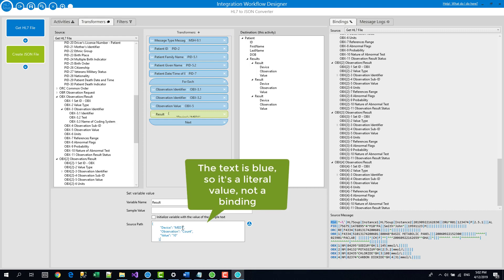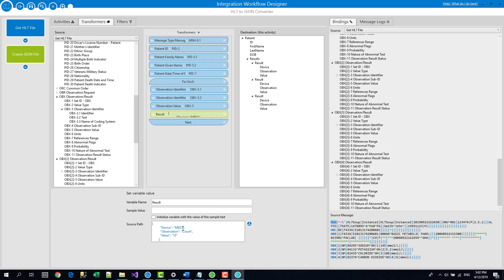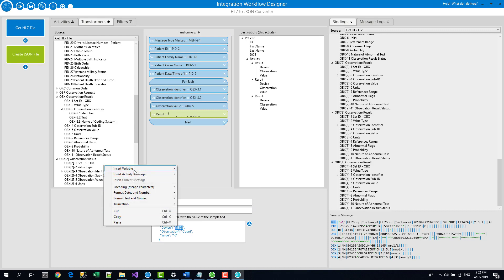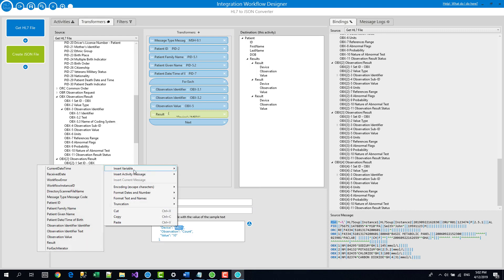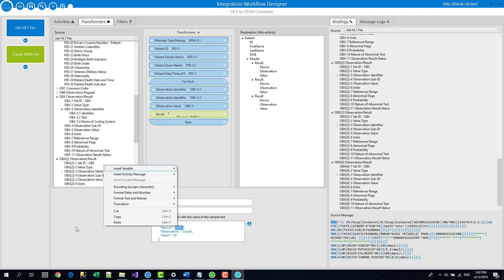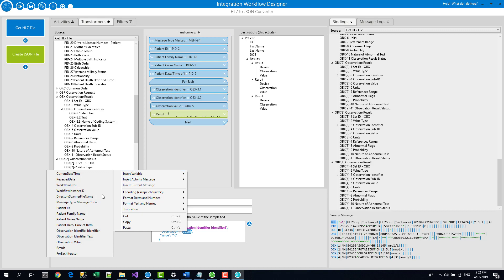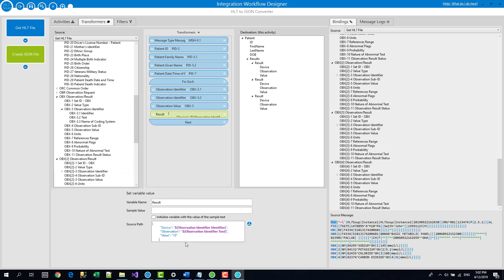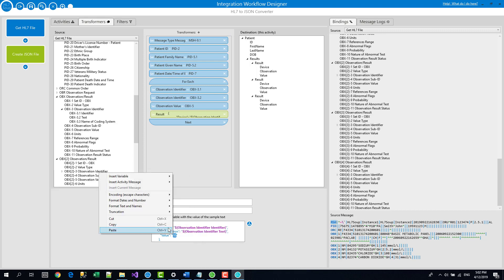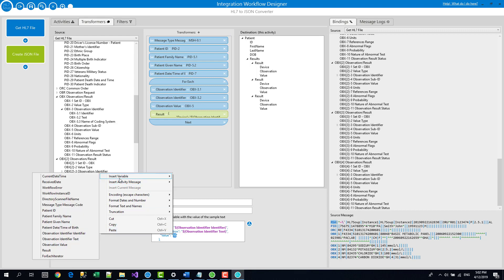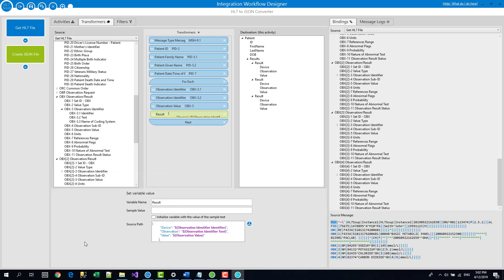And now I just need to replace these bits of text. So the mid one, I said I was going to use that variable called identifier. For the observation, I will use the identified text. And for the value, I'm going to use the observation value. Okay, so that's mapped together.